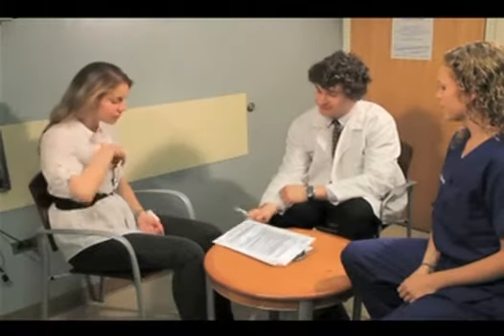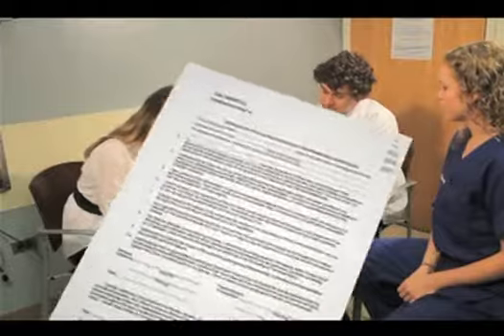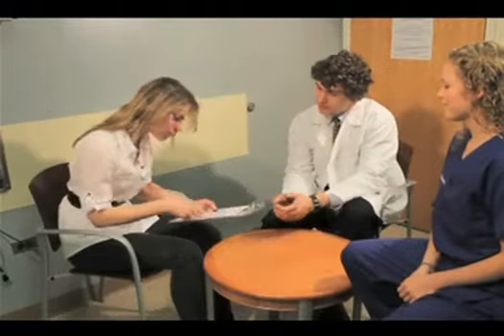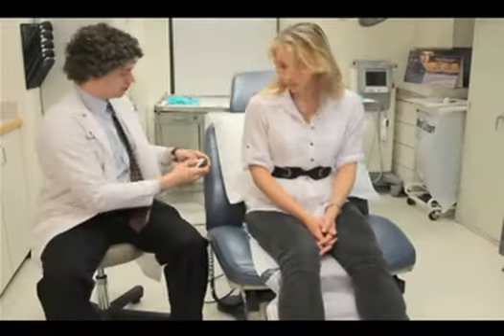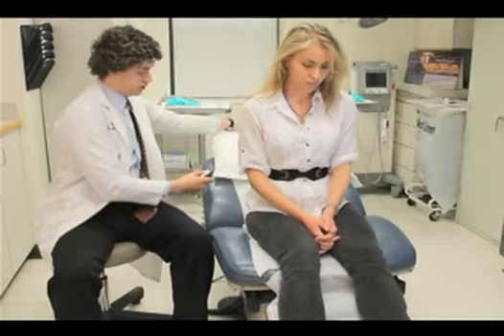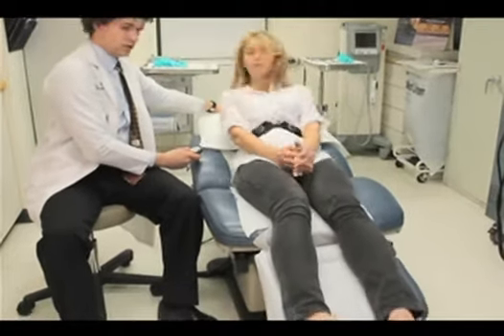When performing any medical procedure, it is important to educate the patient regarding its indications, risks, and benefits. After answering any questions or concerns the patient has, formal written consent must be obtained. Following appropriate timeout protocol, verify the biopsy site and side with the patient. To optimize the performance of a punch biopsy, have the patient recline on the examination table. This will allow good visibility of the site and easy access to it.